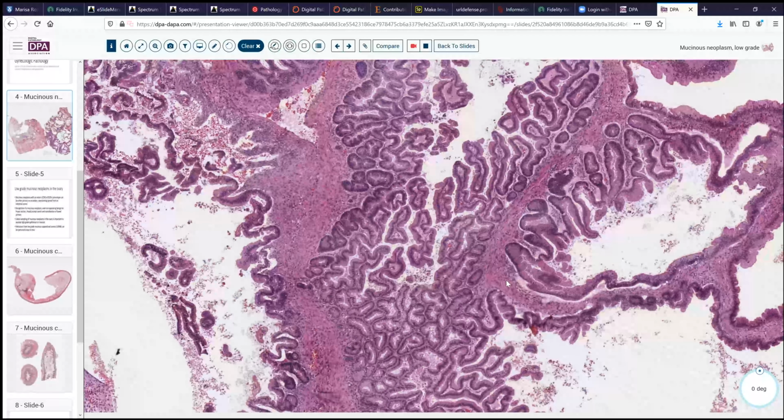So, what are we going to do with this? This is a diagnostic challenge, particularly in the setting where we don't have the contralateral ovary and the appendix has been removed.